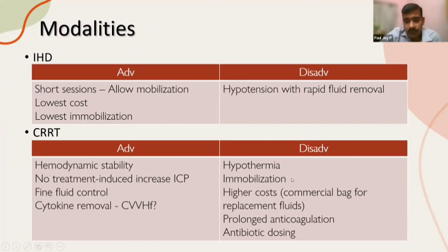Disadvantages are that it is prolonged, there is risk of hypothermia, the patient needs immobilization, the costs are higher, and the patient might need prolonged anticoagulation and thereby have increased bleeding. And because of continuous antibiotic removal, therapeutic levels may not be achieved with CRRT.